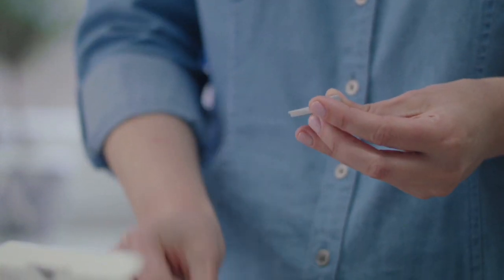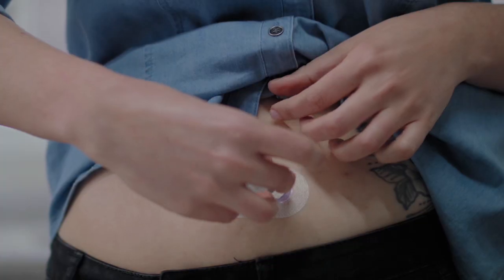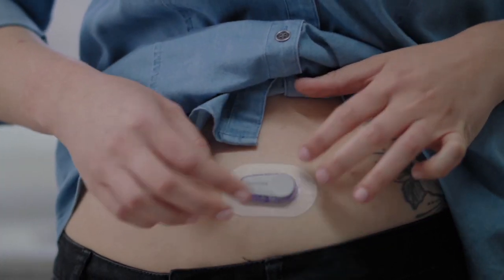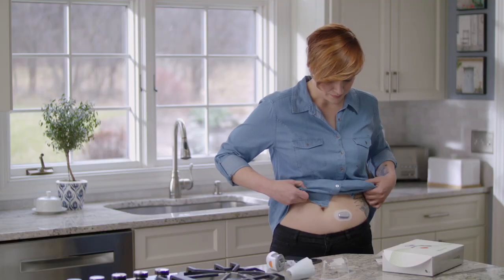Now it's time to attach your transmitter. Clean your transmitter with an alcohol wipe and let it dry. Insert the transmitter tab into the slot. Snap the transmitter firmly into place. Rub around the patch 3 times. Once your transmitter is attached, you can swim, bathe, and shower like normal. You have successfully inserted your sensor and attached your transmitter.